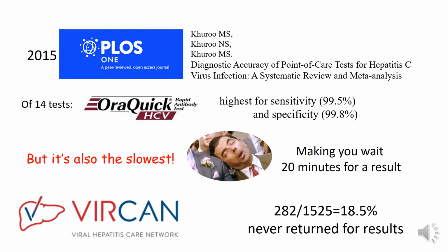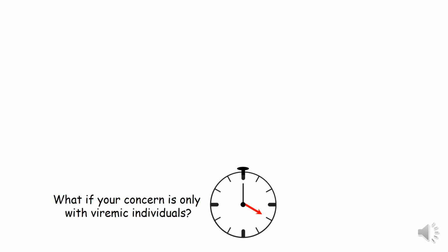Now, one of us, Dr. Jordan Feld, asked, do you really need to wait that long if you're only concerned with viremic individuals? And the answer is no, you don't. You only have to wait 5 minutes. And here's the evidence for that.